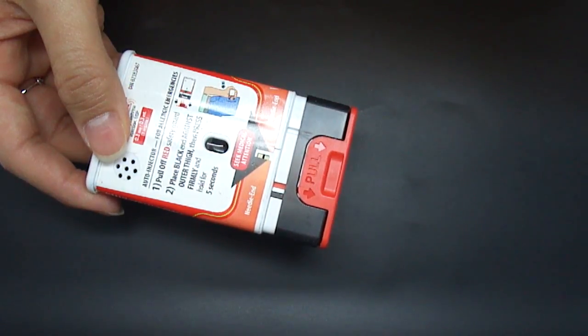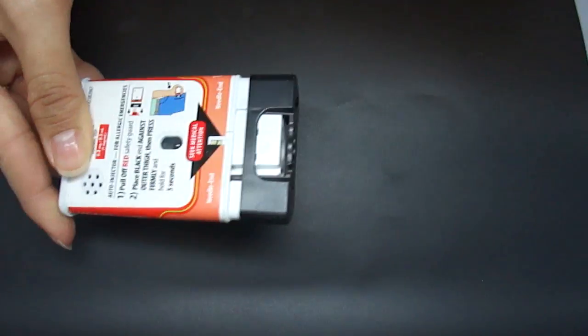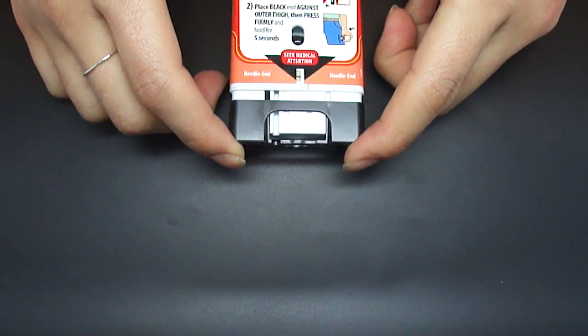If you are ready to use, pull off red safety guard. To inject, place black end against outer thigh, then press firmly and hold in place for 5 seconds.